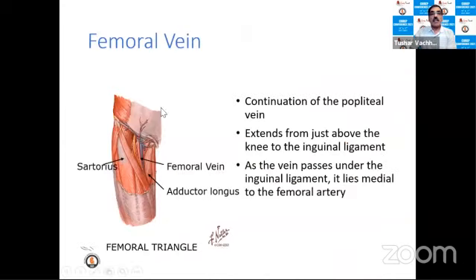And in the leg, as Dr. Manisha Sahai was mentioning, this is probably a common site where technicians place catheters, in the femoral region. It is again not an ideal site for non-tunneled catheters because the risk of infection, for obvious reasons, is very high.